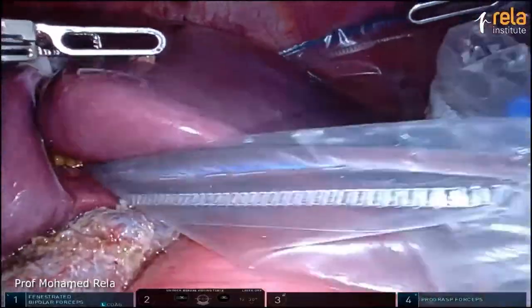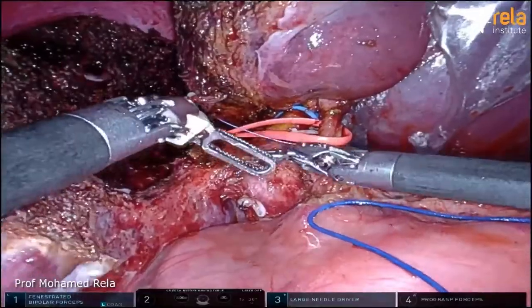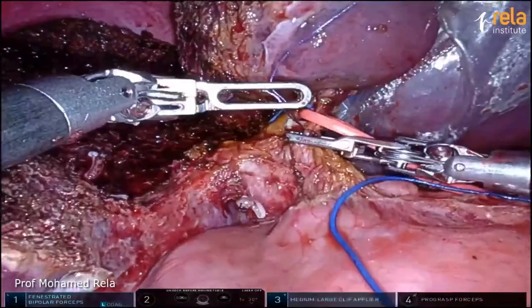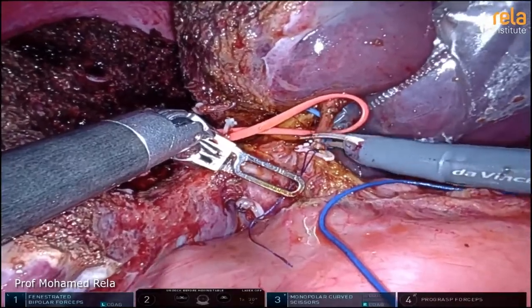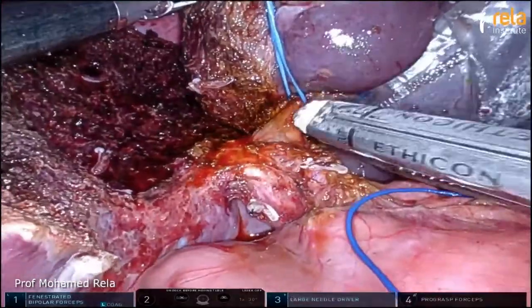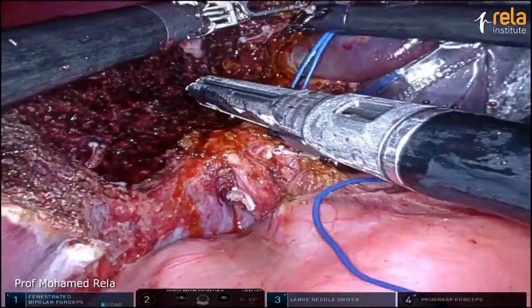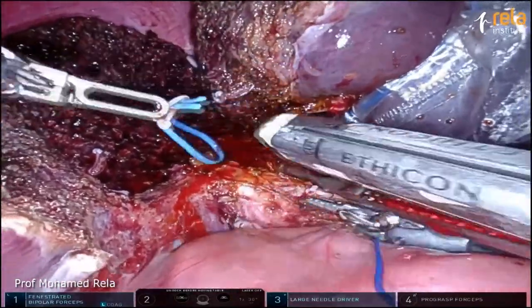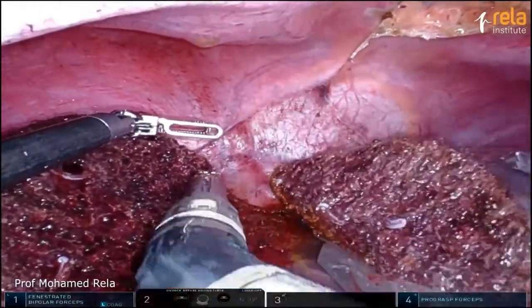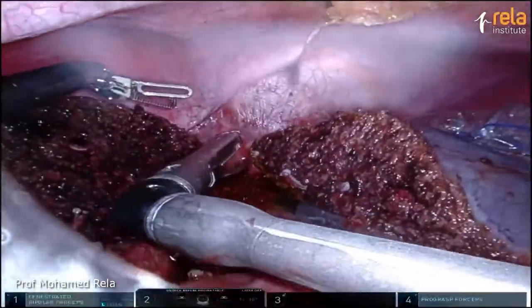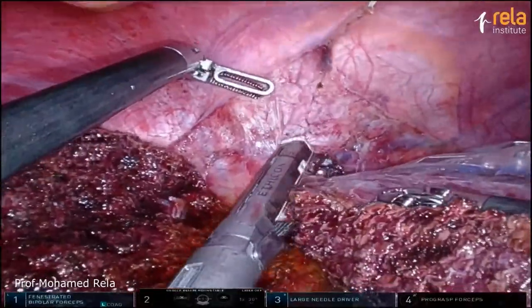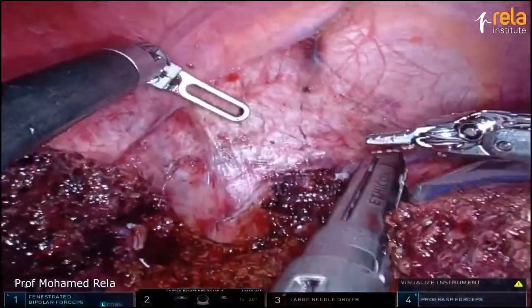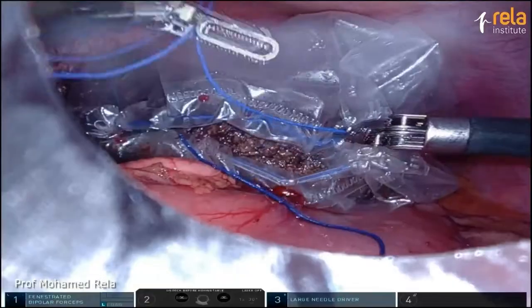Put a bag first and put the gallbladder and the falciform inside it. We give heparin — about 3000 units — and then five minutes later divide the artery. The warm ischemic time we used to calculate from the time of division of the artery, but now we feel that it really starts from the time the portal vein is divided. This is a stapler from outside — bedside surgeon's tool. You can also use a robotic stapler; we didn't use it because of the costs involved. One has to be very careful not to pull the vessel and tear the left vein near the junction with the cava.